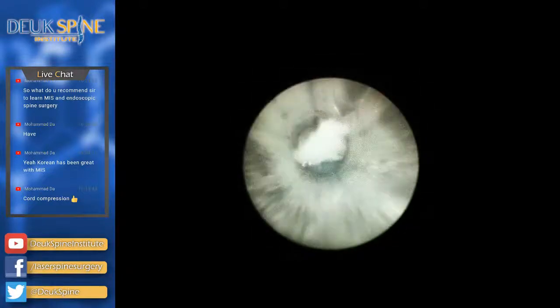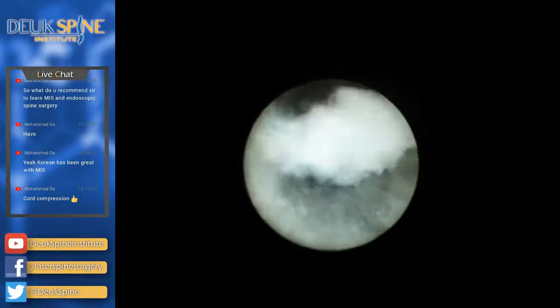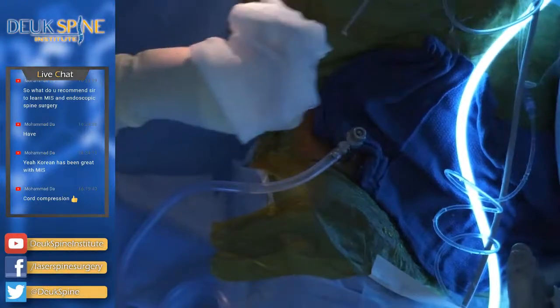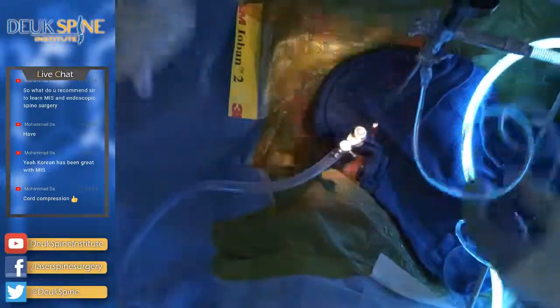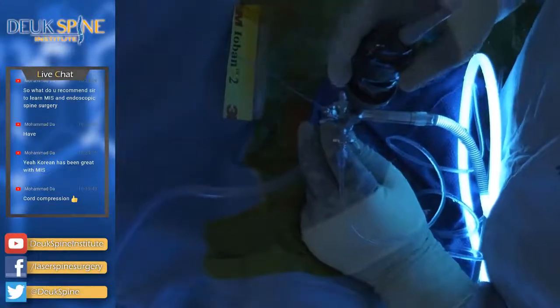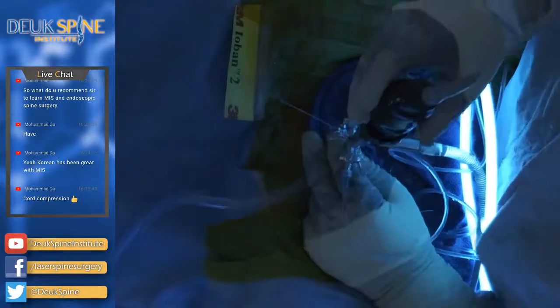Most of the time, there's another big piece. You see that? Incredible. Yep, come on now. You've got to coax it out a little bit. I've got pepperoni pizza. Come on. Just kidding. You see that tear in the back of the annulus, and the herniations are now coming back through it? We call that a reverse herniation. And Deuk Spine Institute was the first to coin that in our paper that we published back in 2012, I believe, or 13, whichever one mentions that. Reverse herniation concept.